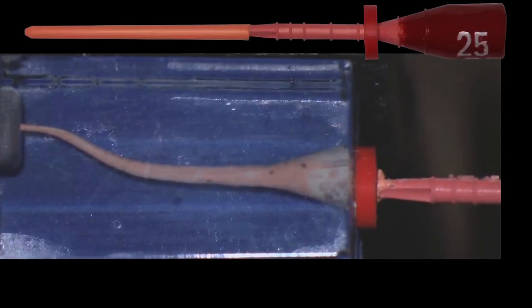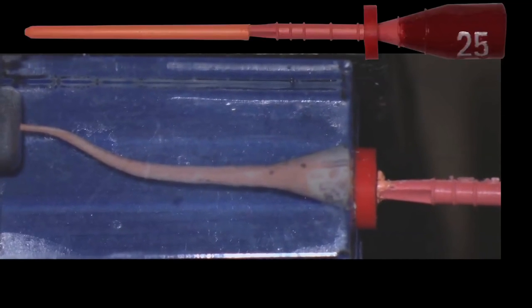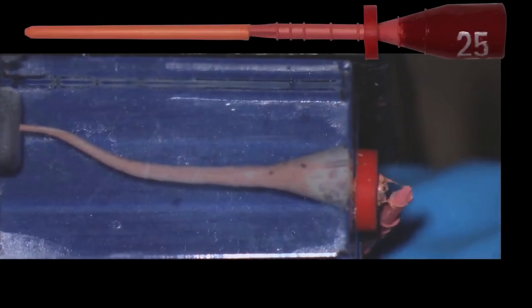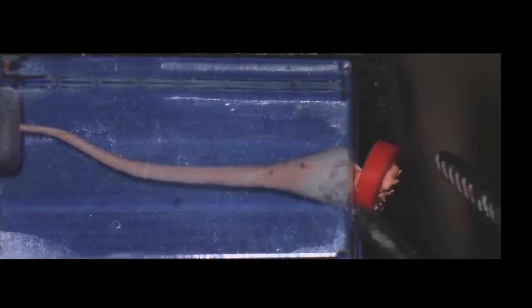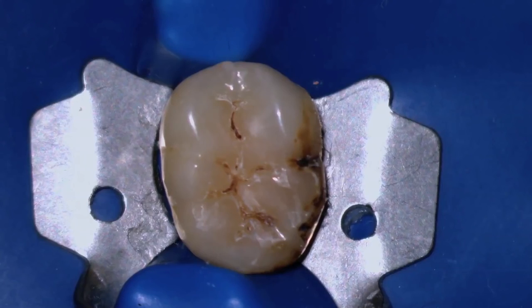WaveOne Gold will also have paper points, gutta-percha points, obturators, and size verifiers that match the taper of WaveOne Gold. After you have seen the use of WaveOne Gold on a plastic cube, let me take you through a clinical case. And now we are going to see this molar, this lower molar, done with WaveOne Gold.